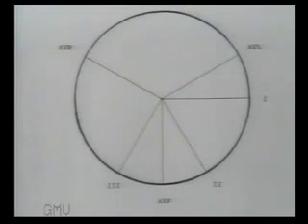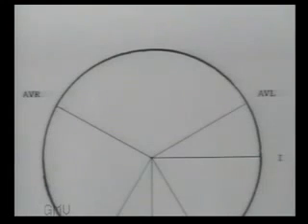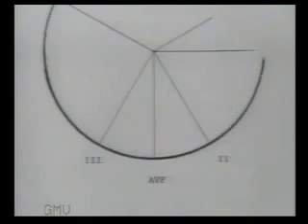What we must remember always is that lead 1 and AVL are anterior leads directed to the anterior and left wall of the left ventricle, while leads 2, 3 and AVF are inferior wall leads directed to the inferior wall of the left ventricle. Leads 1 and AVL are leads to the anterior wall, and leads 2, 3 and AVF are leads to the inferior wall.